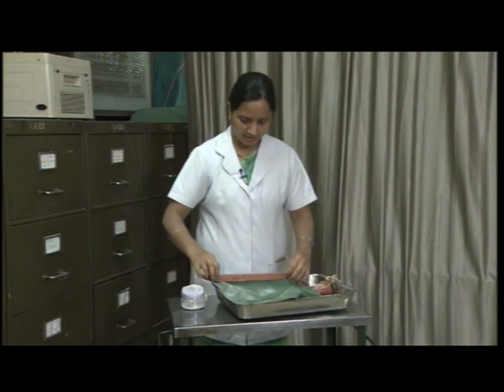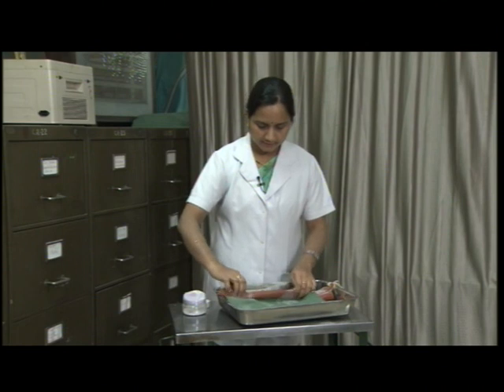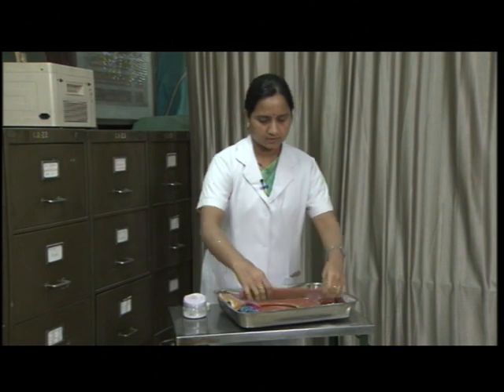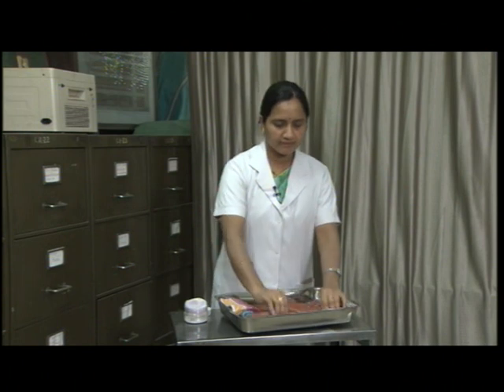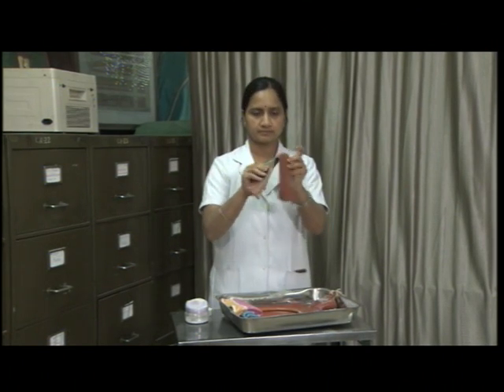For Macintosh, we have to take care that we should not fold rubber goods. As rubber goods deteriorate with age, heat, chemicals, and sunlight, we have to prevent exposure to sunlight, heat, and chemicals. We never fold rubber goods or Macintosh — we have to only roll it and store in a dark place.